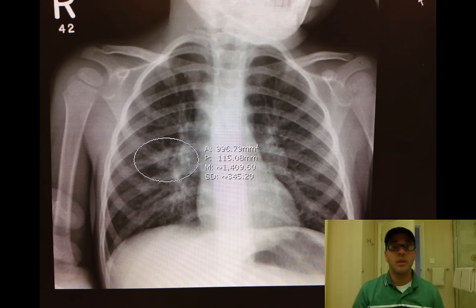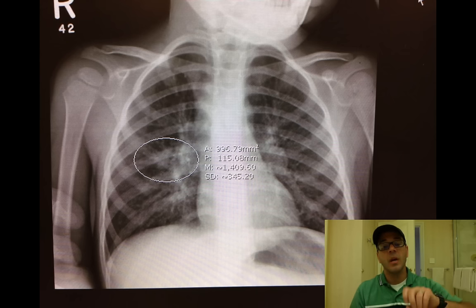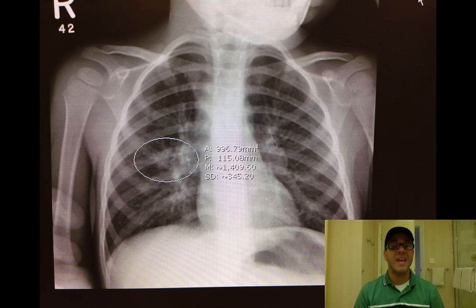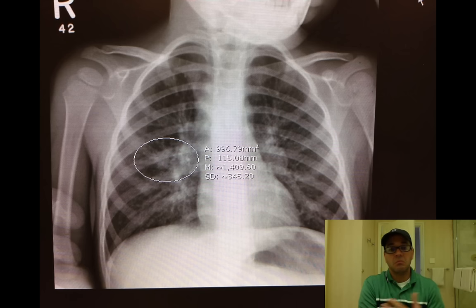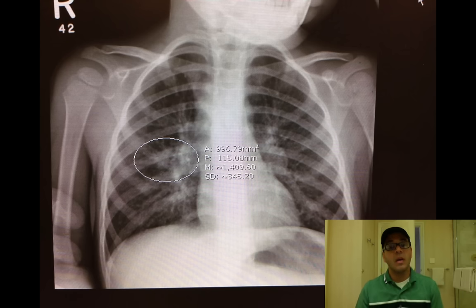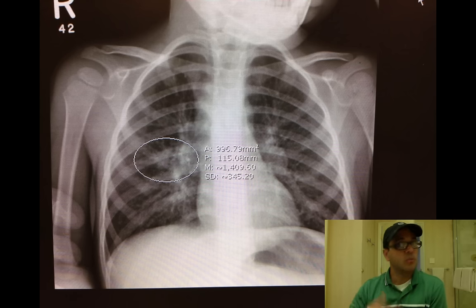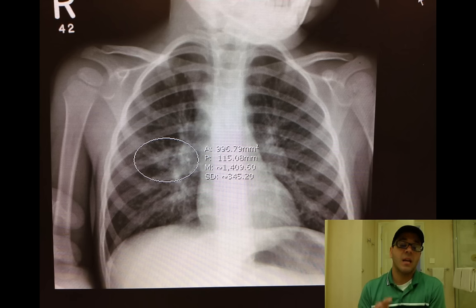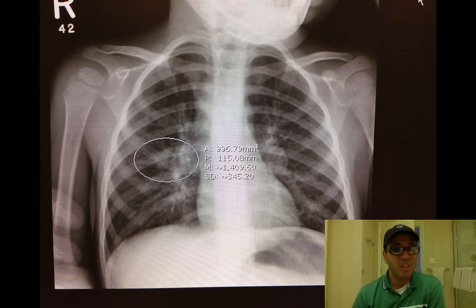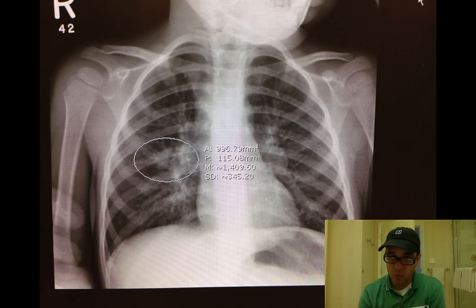Next case: this one is not as obvious as the previous X-ray. This was read by the radiologist as pneumonia, but the ER doctor who saw the X-ray first did not read it as pneumonia — it could have been read as a more pronounced hilum from inflammation, bronchiolitis, or a viral process. Because we did not read it as pneumonia, we had to call the patient, put them on antibiotics, and arrange follow-up. The main point is that some pneumonias are very evident, but this one not so much — you have to look carefully at the lung tissue.